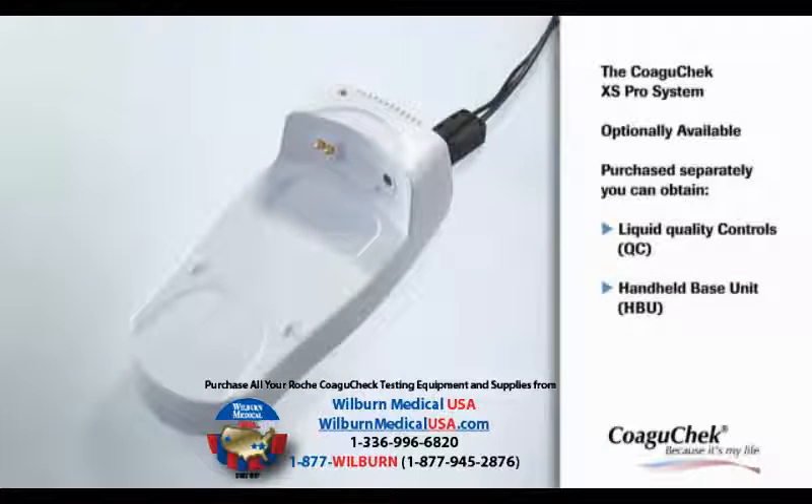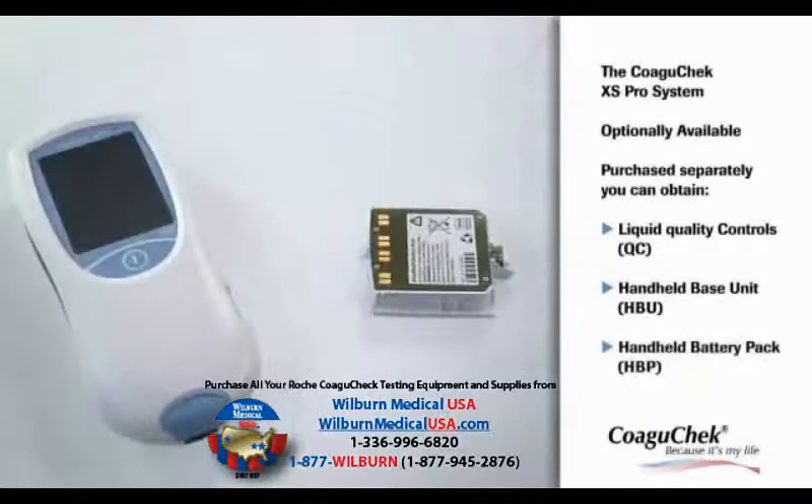The optional Handheld Base Unit provides connectivity to a data management system. Instead of batteries, the rechargeable Handheld Battery Pack can be used.